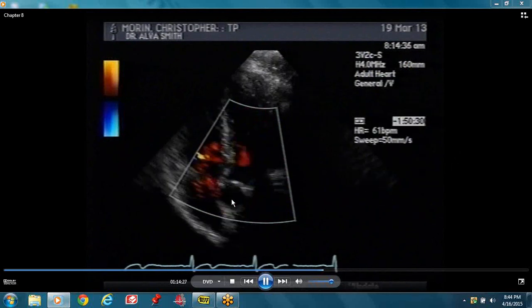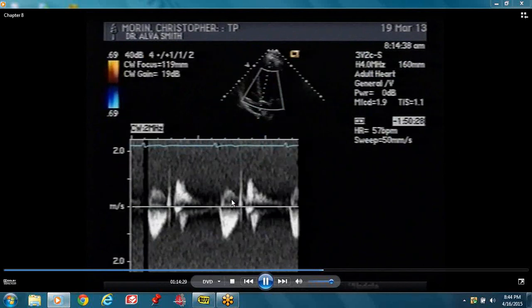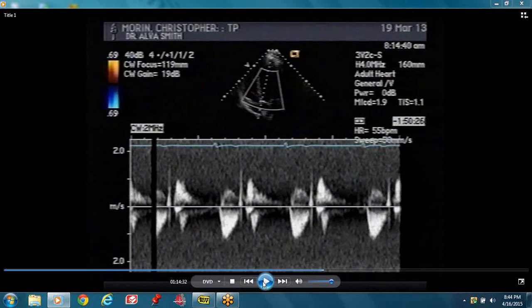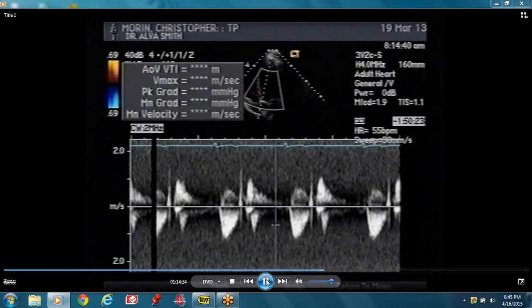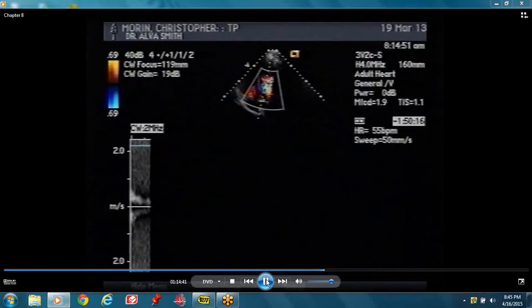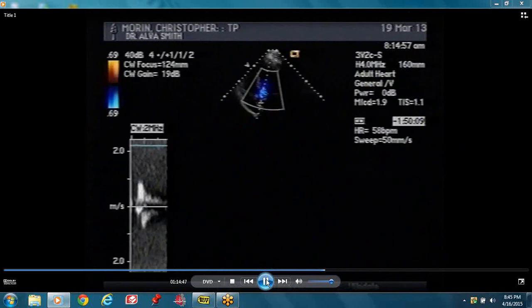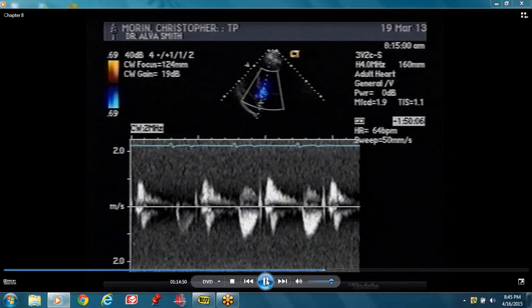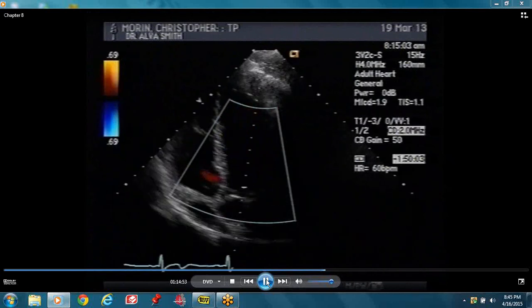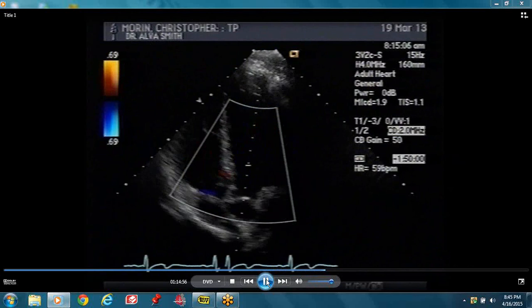For the five chamber view cursor, to get the aortic valve flow, put it directly into the aortic valve and you'll get the flow across the aortic valve — below the baseline. Trace it to get your aortic valve VTI. The computer will give you the TVI, the mean gradient, and the peak gradient.